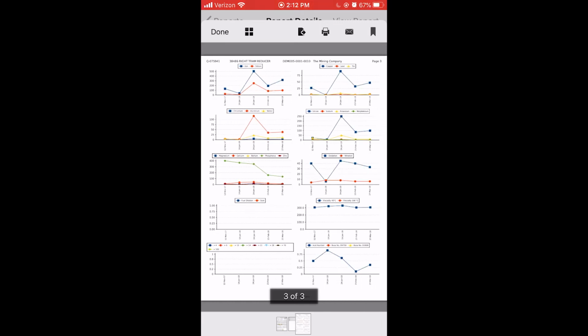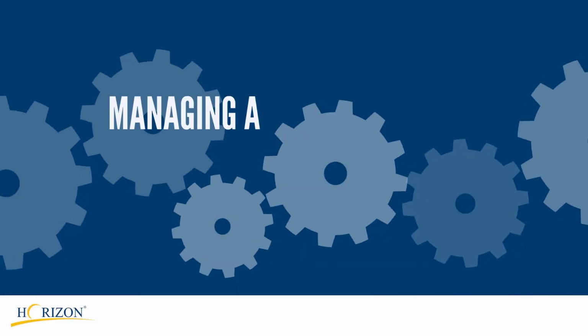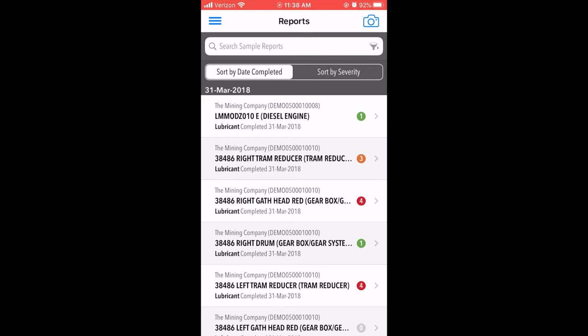The three options at the top of the screen allow you to send the PDF using other applications on your mobile device. Send it to a connected printer or flag the report to access later. The Equipment Manager features in the Horizon app allow you to update component details, register new components, copy existing components, or transfer them between accounts.